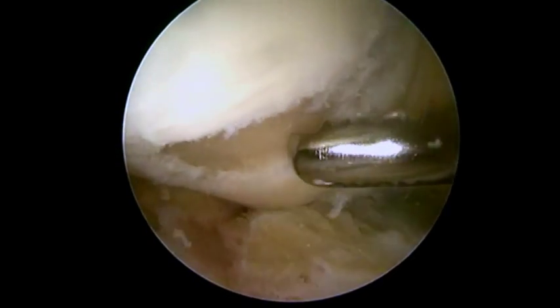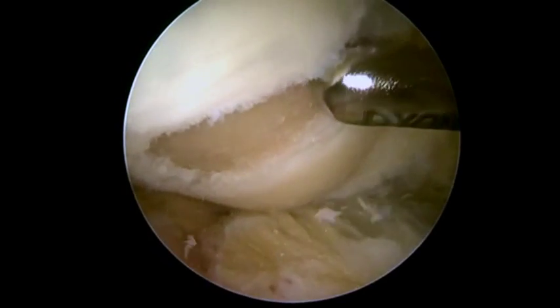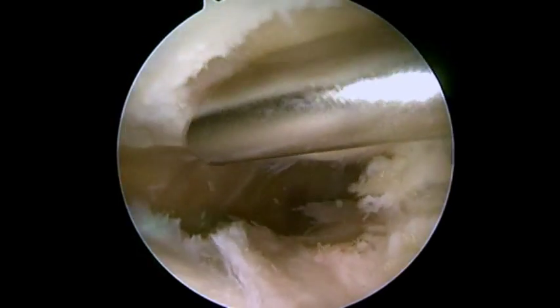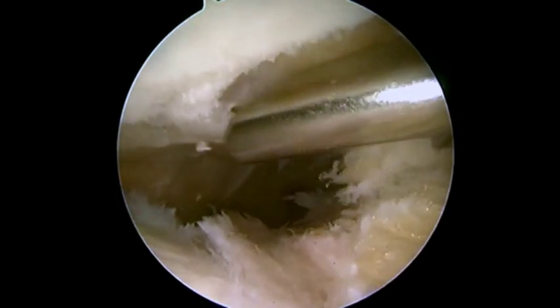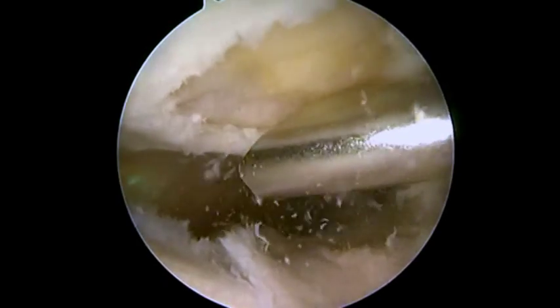And as you can see, we debride the remaining cartilage off of the bone to create a clean surface of bone with nice stable edges. Depending on whether the lesion is medial or lateral, it is useful to make an accessory portal in the patellofemoral joint to aid in preparing the lesion and delivering the BioCartilage.